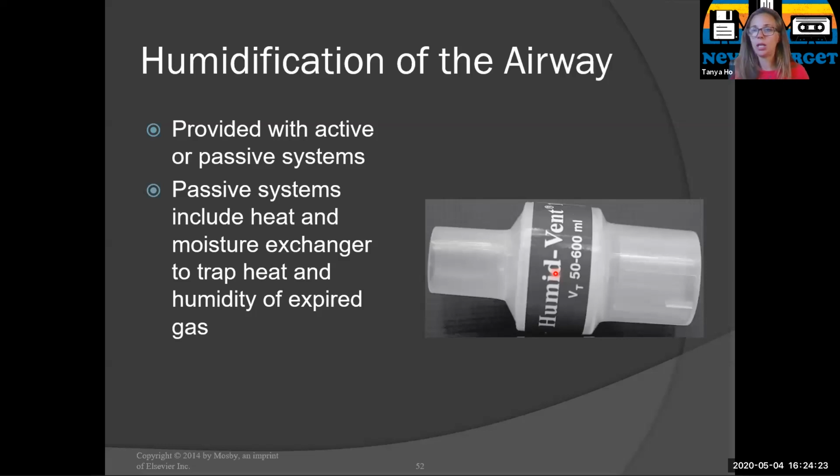So generally speaking, when we initially intubate a patient, we more than likely put them on this unless we have a reason to go straight to a heated system. Reasons to go straight to a heated system are copious thick secretions, or if you know they're going to be intubated for a super long time. But generally speaking, patients are pretty much extubated within a few days. So most patients can be managed with this HME.